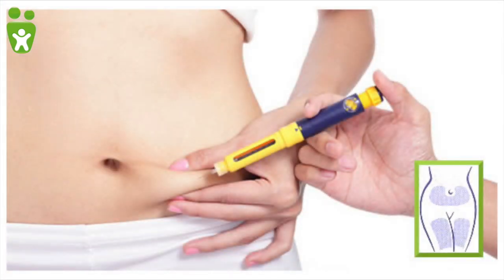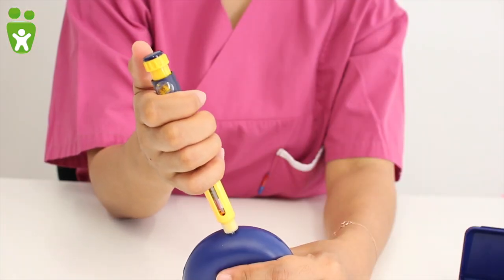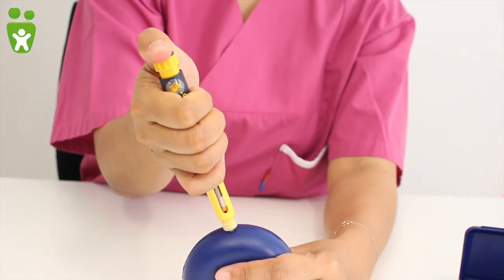For subcutaneous injection, the following areas of skin are convenient: a fold of skin on the abdomen or on the thighs. It is not necessary to disinfect the injection area, but it can of course be done if no skin irritations occur. Take the skin fold between forefinger and thumb, set the pen and press the needle into the skin, then press down the button.